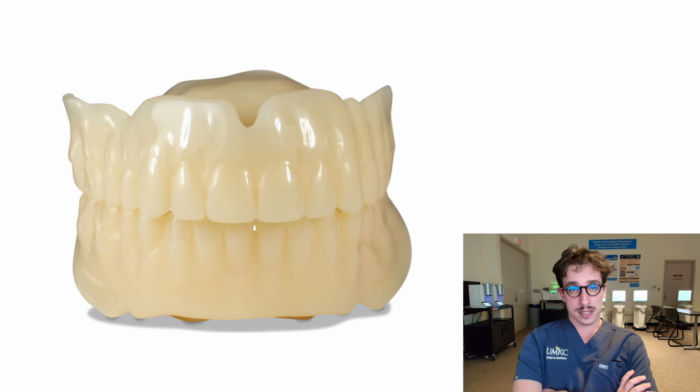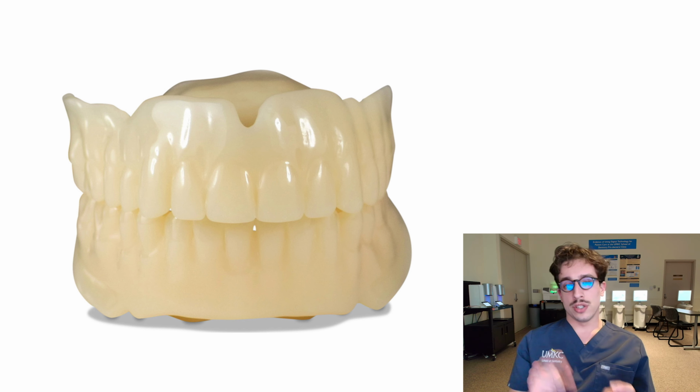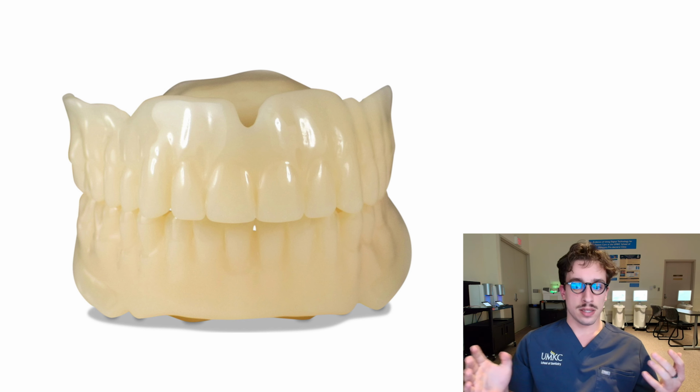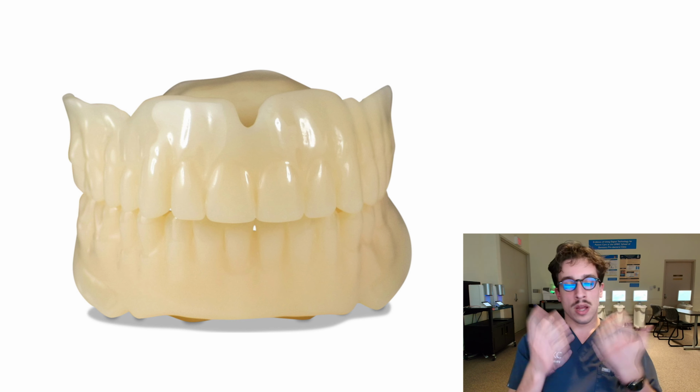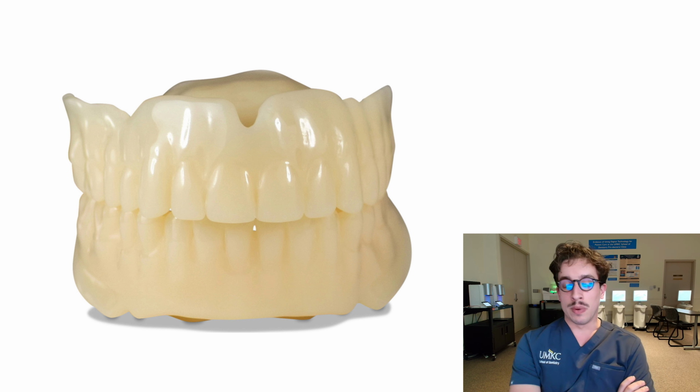So like I said, this is a monolithic material that we're making this out of. It's just going to be white. It's not going to be gingiva or anything like that. And the purpose of this is so that we can get an idea of what the setup will look like in the patient's mouth. So you're going through and you're checking everything just like you would for a posterior try-in or an anterior try-in. You're checking the occlusion, you're checking the shape of the teeth, you're checking the occlusal plane, you're checking to see lip support, everything that you all know that you're doing in the appointment, you'll be doing with this.